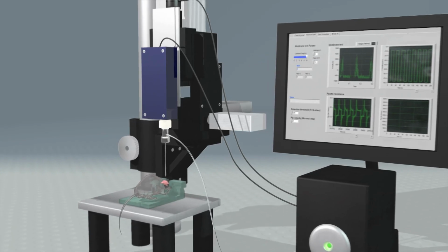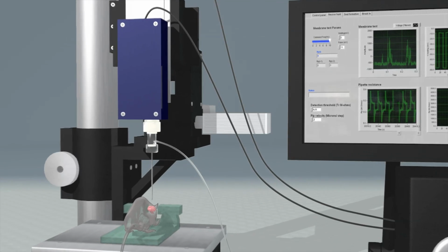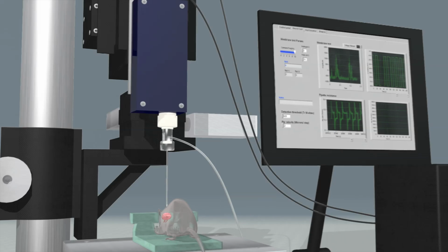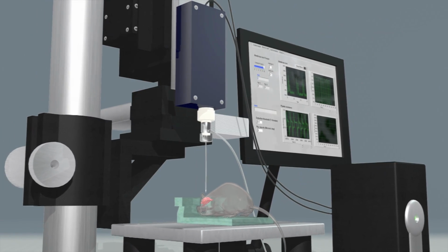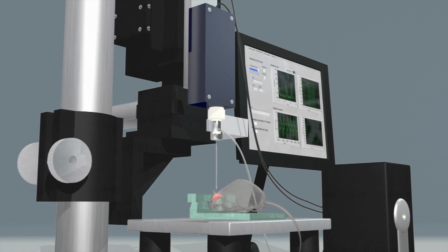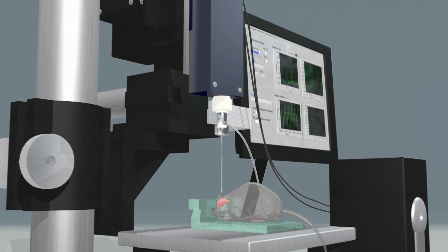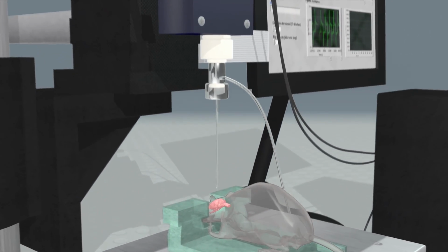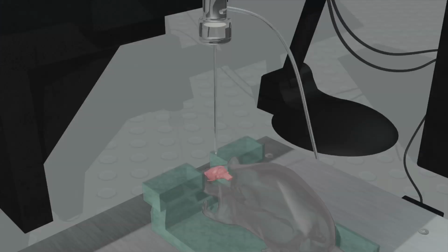The procedure of using pipettes to record neural activity, known as patch clamping, has been performed by humans for decades. But in the living brain, it is difficult to do, something of an art form that only a small number of people have mastered. This robot is controlled, in contrast, by an algorithm, a piece of software that enables neurons to be detected, electrically recorded, and molecularly harvested in a high-throughput fashion without requiring human intervention.